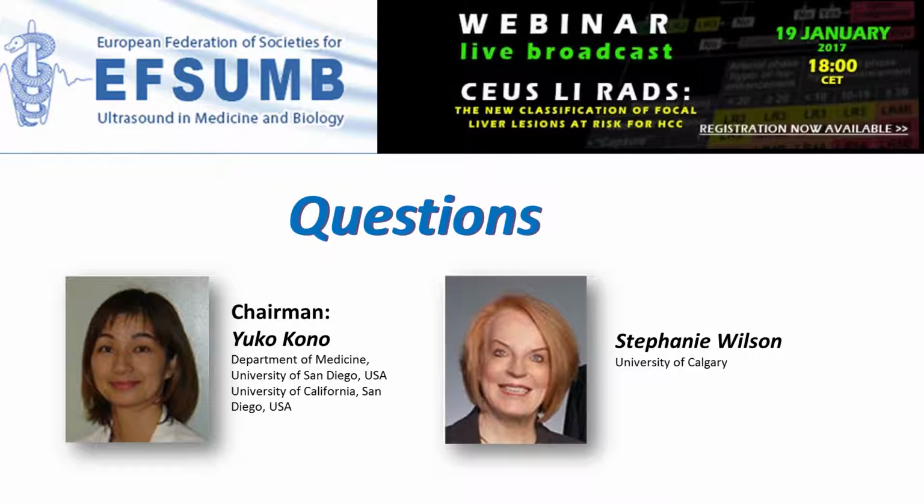It does require a quite steep learning curve. The studies are never easy, and when you're looking at cirrhotic livers, this in fact is one of the more difficult areas for CEUS. And so I think people that are dedicated to the performance of CEUS will do better than the casual performer.